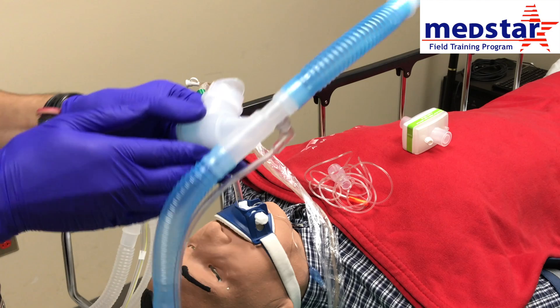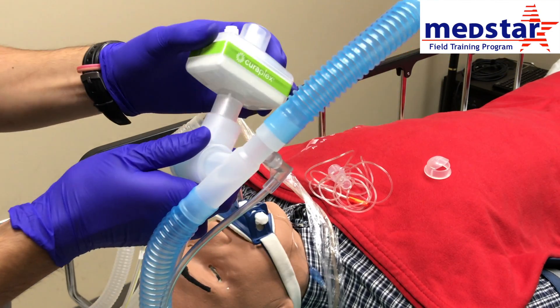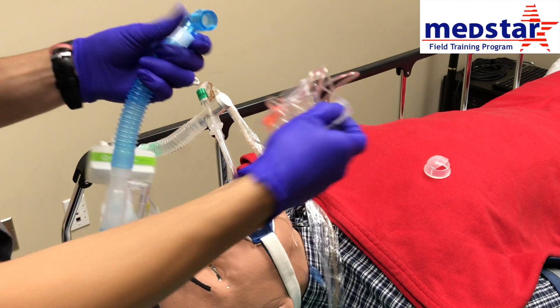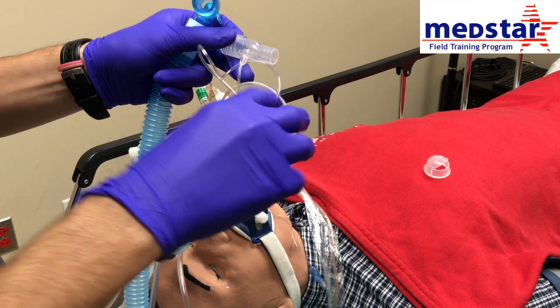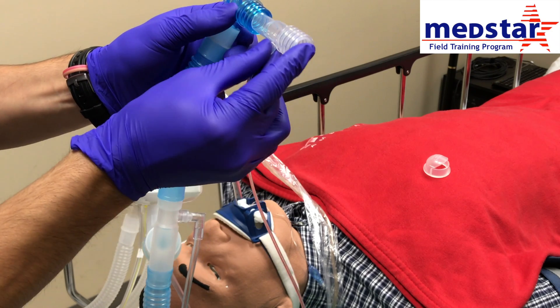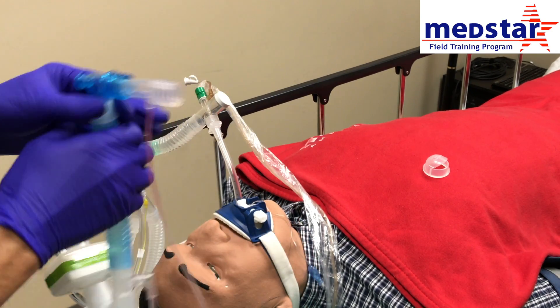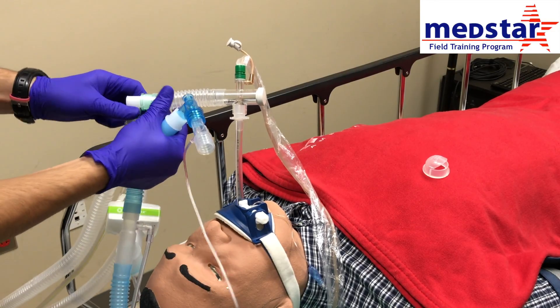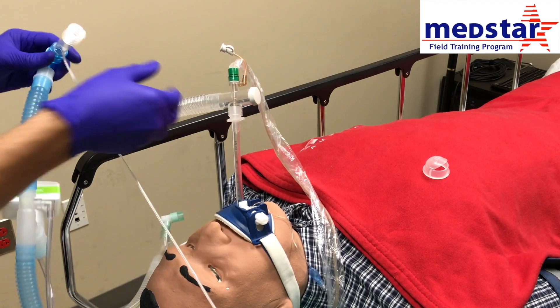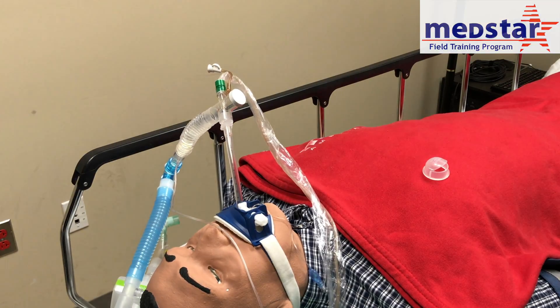Grab your circuit, remove the pop-off, and attach your HEPA filter. Take your capnography and screw it into your monitor first so that it zeroes out. Once it's zeroed, go ahead and connect your capnography to your circuit. Then disconnect the hospital circuit from the patient and connect our circuit to the patient. Your patient is now being ventilated through our ventilator.